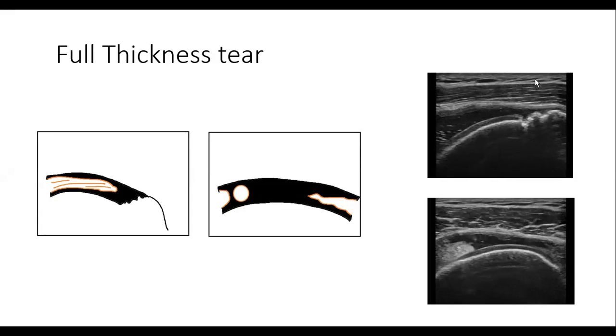So here, that's skin, subcutaneous tissue. That's the muscle, deltoid muscle. That's bursa, fluid, and the cartilage. And this is bony interface. So you're getting this bright line over the articular cartilage because there is less resistance or impedance to the ultrasound beam. So the cartilage is sending more echo back. So you're getting more echo from the rim.